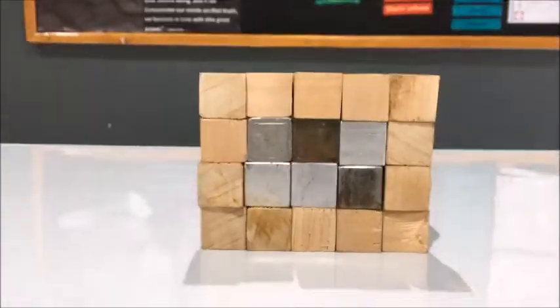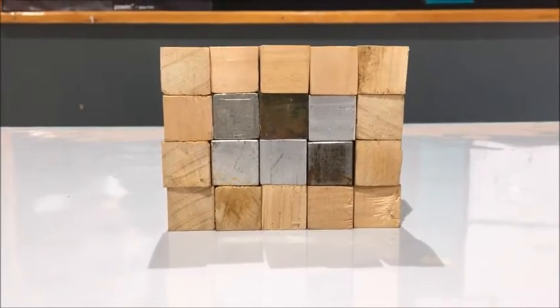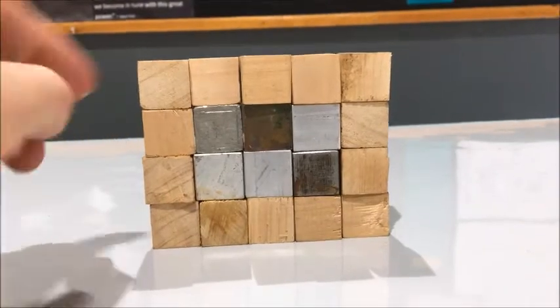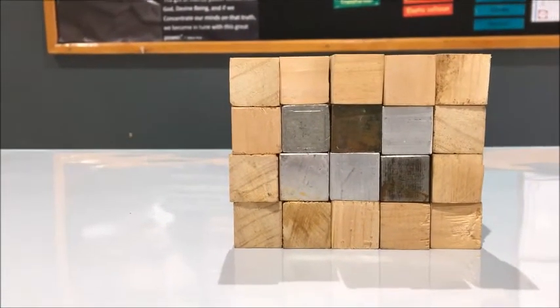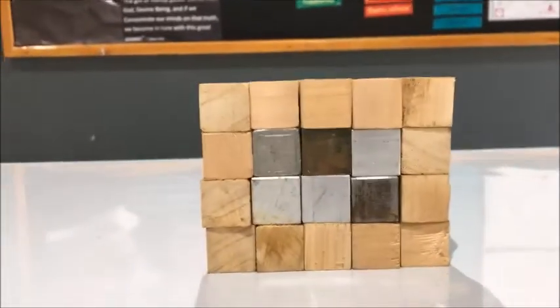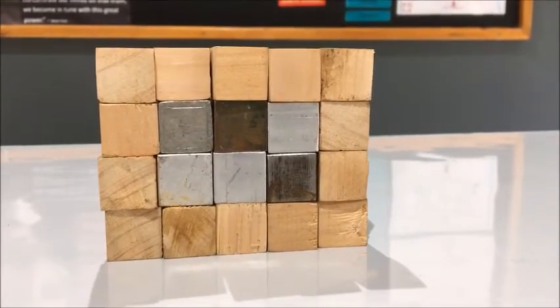So you may have noticed some of the X-ray production questions, I think it's the production ones, you've got things where X-rays have to pass from flesh into bone and then out of flesh again. So here is something a little bit like that, but I want you to realise now that this is actually something that is broken down into slices. Now I'm considering this like one slice of the thumb.